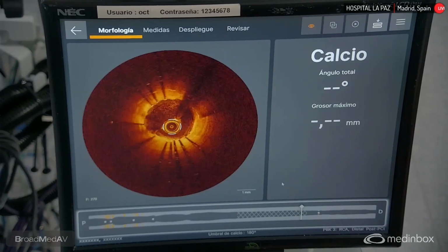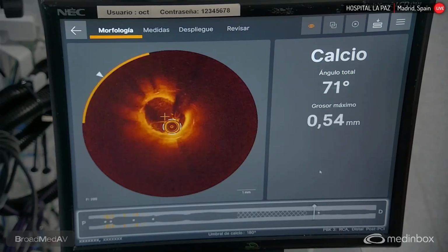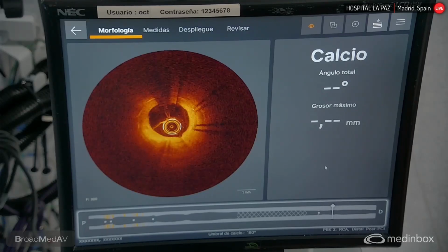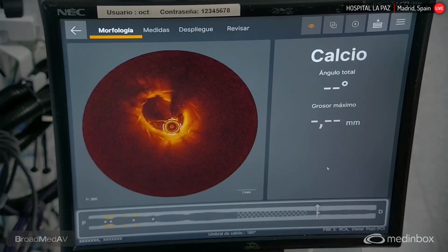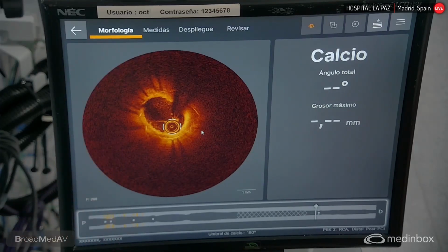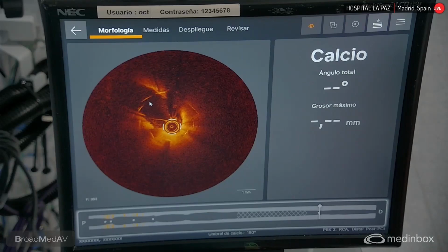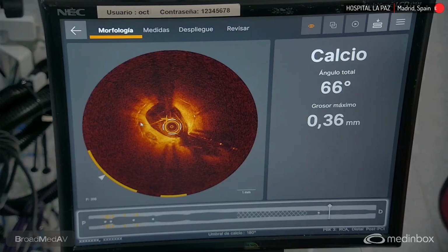You can see the space between the two stents because obviously the tissue doesn't disappear, but the stent seems to be a good span, circular. Some tissue before the bifurcation, proximal to the bifurcation. There's some moderate restenosis. You can see the ostium of the posterolateral branch with uncovered struts.